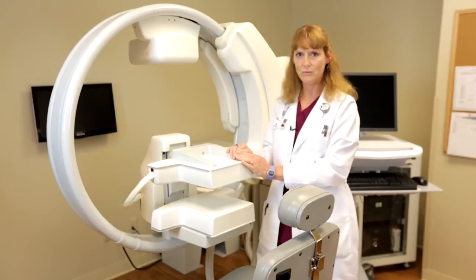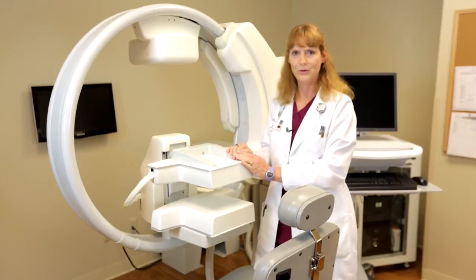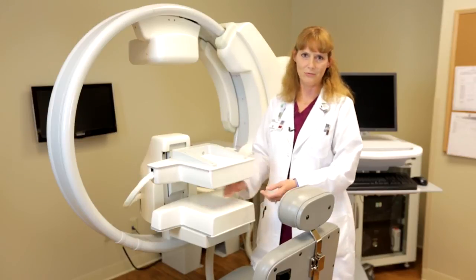Once the 10-minute picture is done, we then move on to the second view, which is typically the next CC. Once we're finished with that CC, we then will move on to the MLO views.